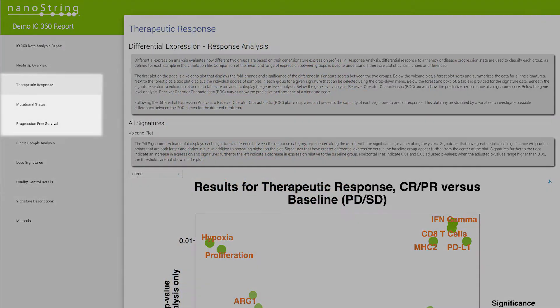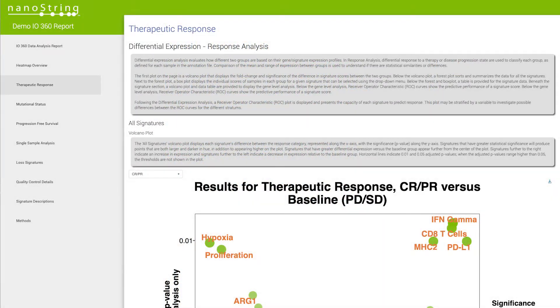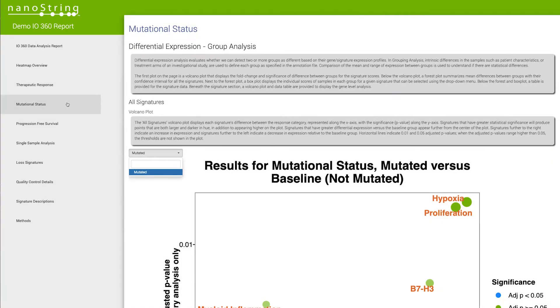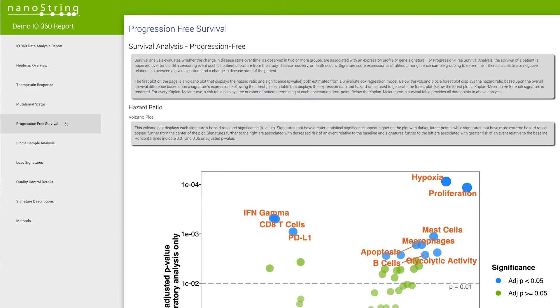The next three sections are customizable content determined by the experimental design and annotations included in the study. They include options for response analysis, grouping analysis, and survival analysis.